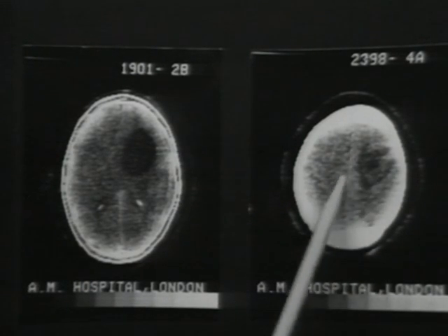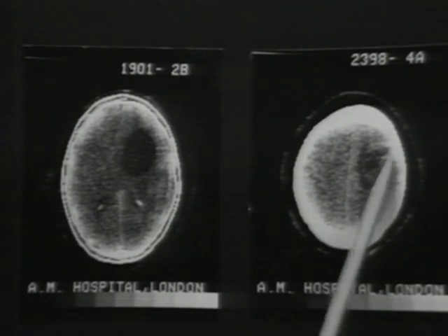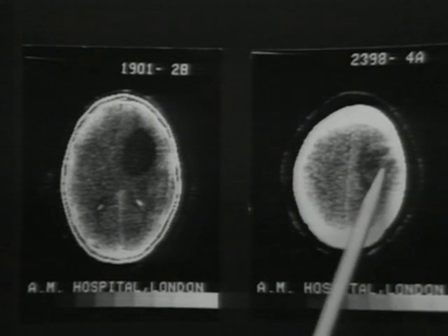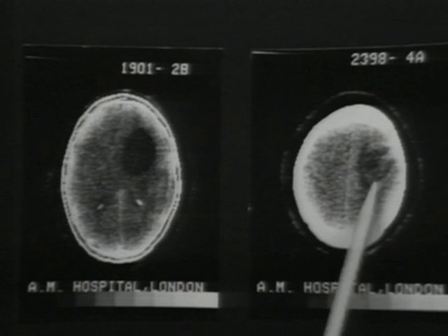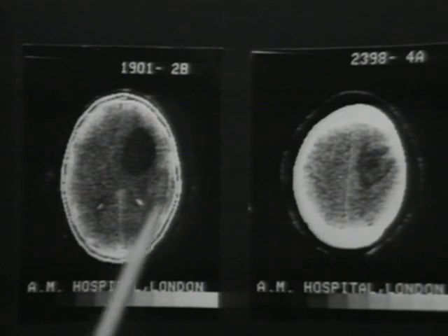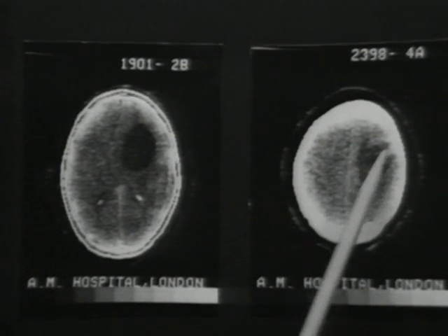Here we have another area of low density, this time less well-defined, and in the center we can see some area of slightly increased density. This is a metastasis from a carcinoma of the bronchus, and the dark area surrounding it is in fact edematous brain, while this rather ragged, irregular area in the middle is in fact the neoplastic tissue.